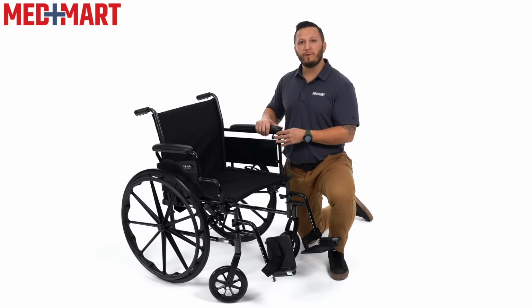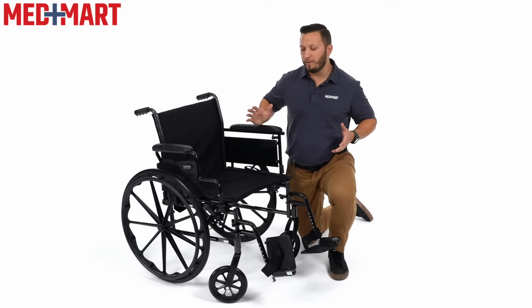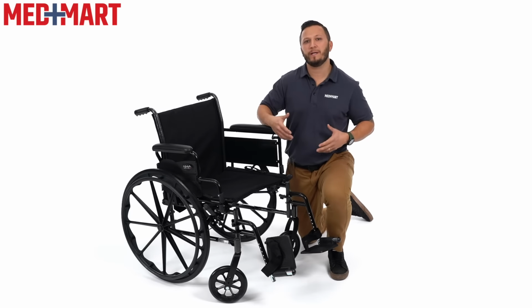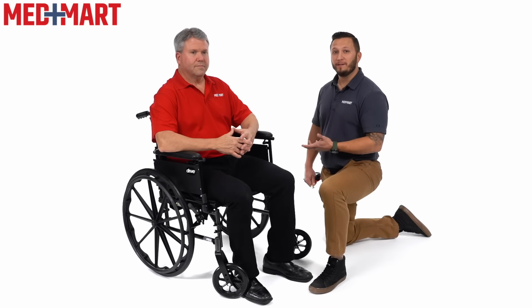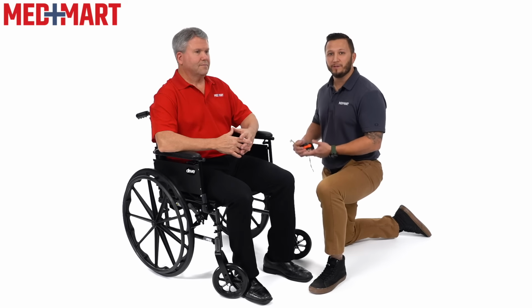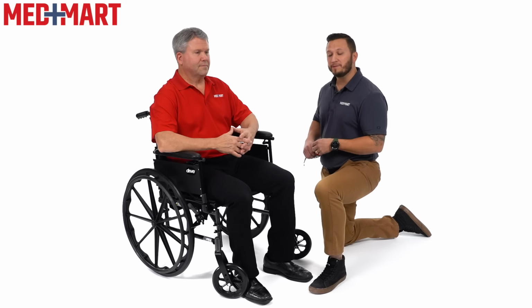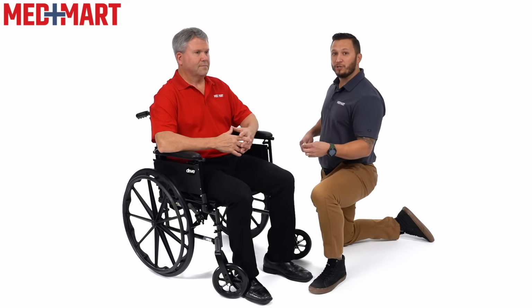However, with the full length, if you have somebody that you know is having a really hard time transferring, getting up out of the chair, they're able to push off the chair from a forward position in order to get up. Here I have Jeff with me. He's going to help me visualize how to appropriately measure for a standard manual wheelchair. Jeff is 5'10" and weighs about 210 pounds. The first thing I'm going to do is I'm going to measure Jeff's hip width.